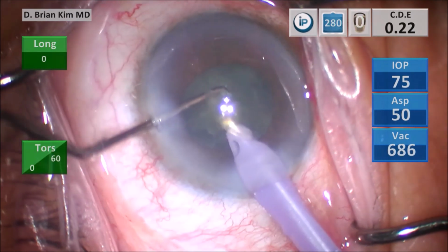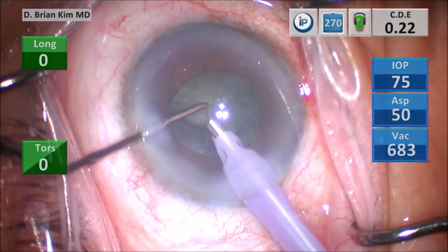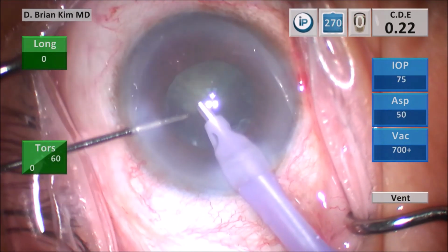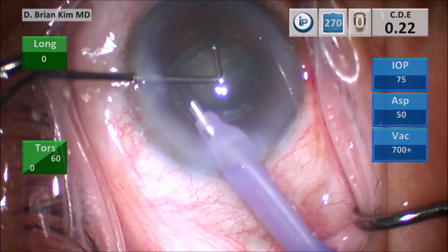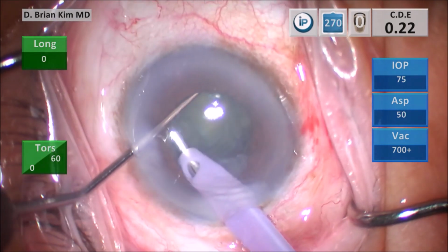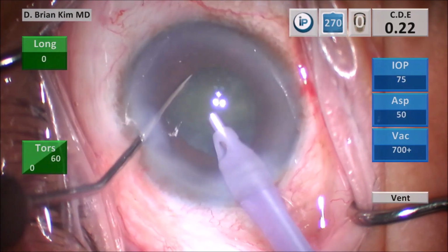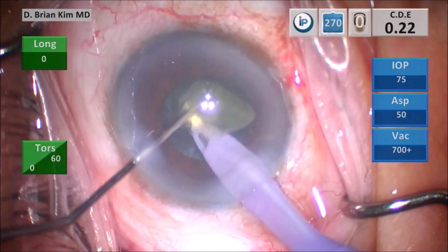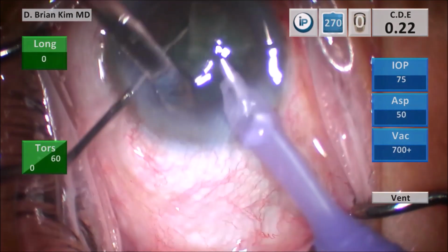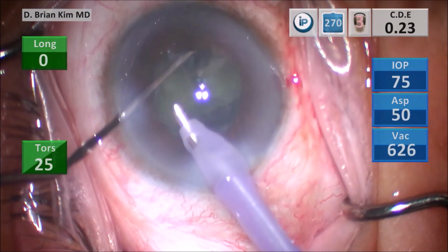Am I over the anterior capsule, under? Am I going to rip the zonules? You will never rip the zonules because after you remove the surface epinuclear material, you can see that little step off into the periphery. You just slide the chopper out underneath that little step off, and you're gliding over the endonucleus, but you're underneath the epinucleus. You're able to slide out, get into the capsular fornix, and then perform the chop maneuver.